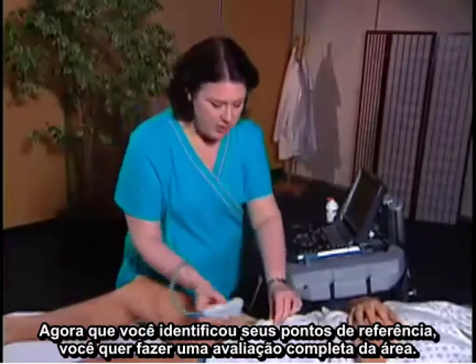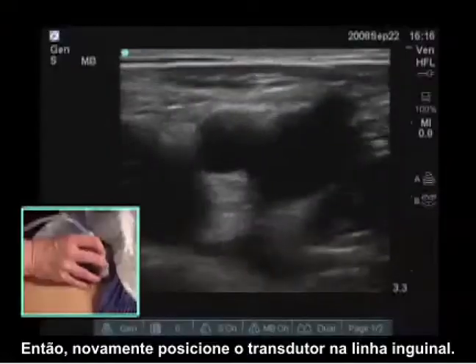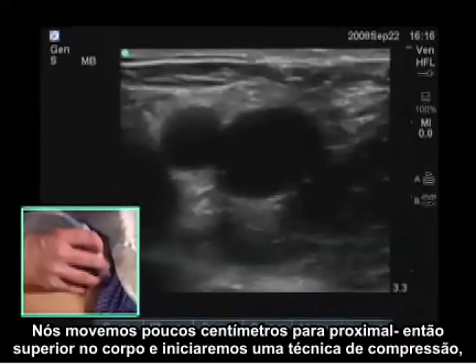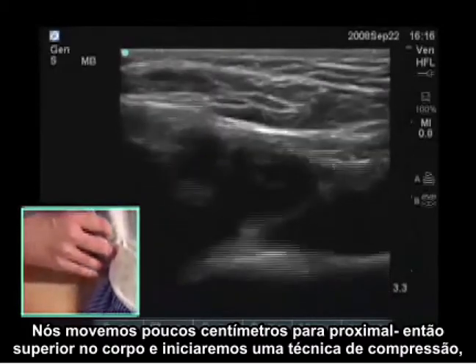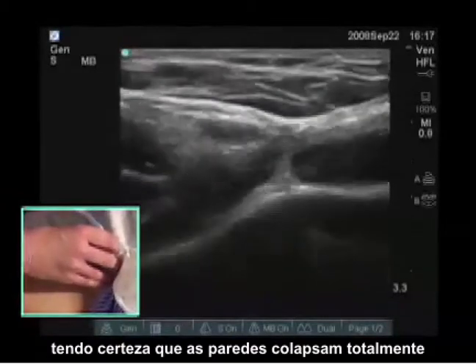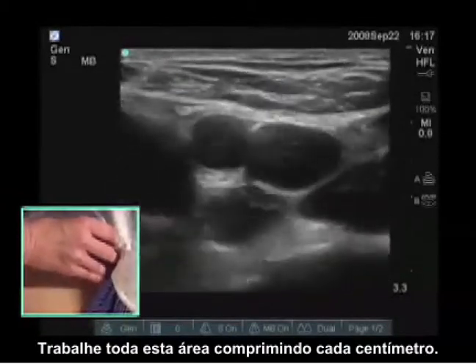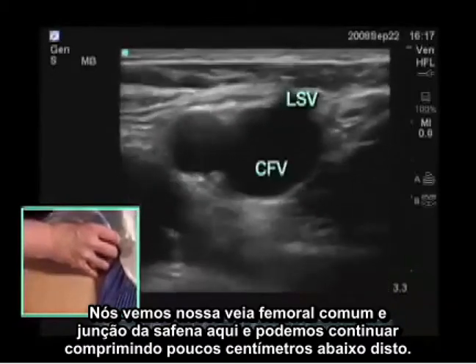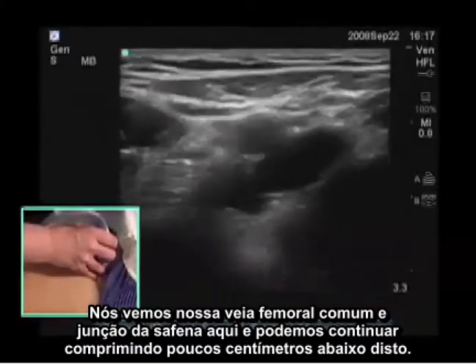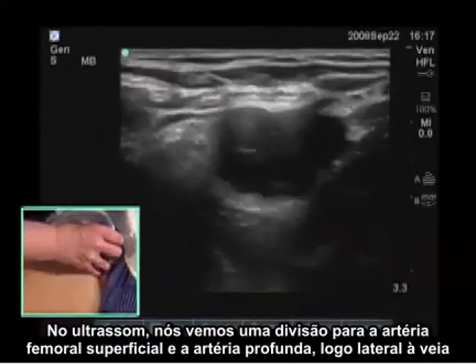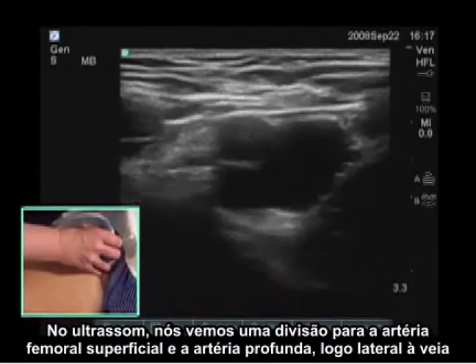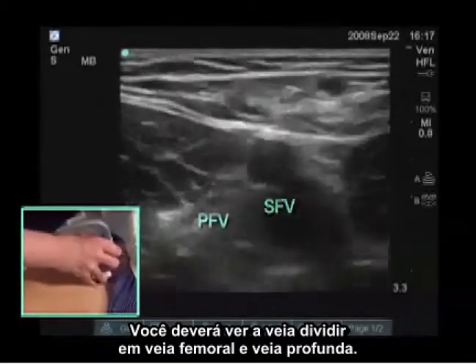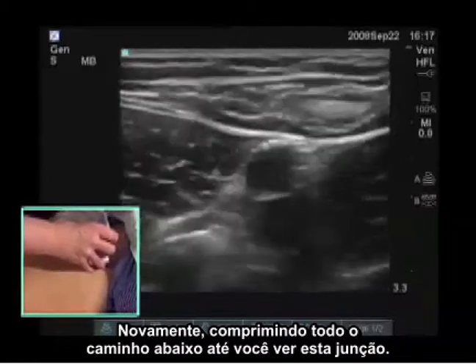Now that you've identified your landmarks, you want to do a thorough evaluation of that area. Placing the transducer at the inguinal crease, compress the area of the common femoral vein. We want to move a few centimeters proximal — superiorly on the body — and start the compression technique, making sure those walls collapse completely. We just work through this area, compressing every centimeter. We see the common femoral vein and saphenous junction here, and continue compressing just a few centimeters below this. On the ultrasound, we see the division to superficial femoral artery and profunda artery just lateral to the vein, and then we should see the vein divide to femoral vein and profunda vein. Compress all the way down until you see this junction.